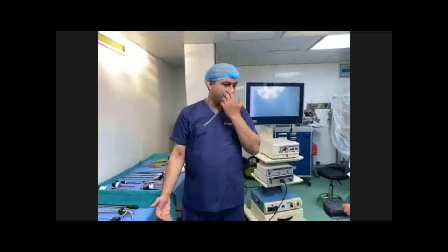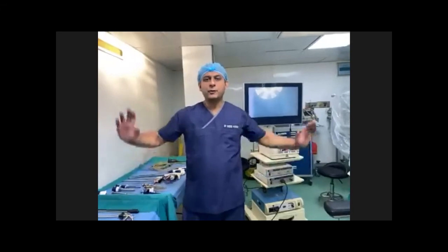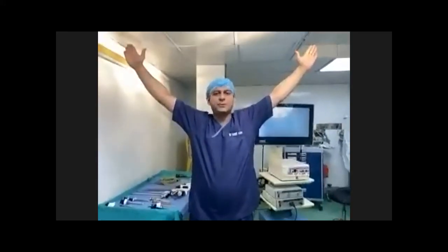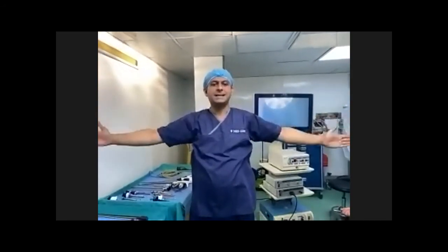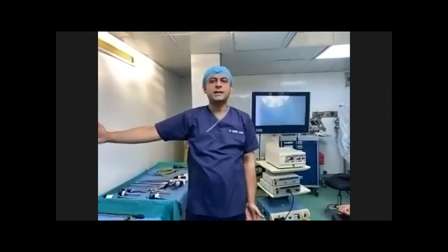I will demonstrate on the patient as well. If you put the arms like this, above 90 degrees, and the procedure is long enough, 1 to 1.5 hours, it will cause brachial plexus injury. So you have to be very careful. Either place the arms up to 90 degrees or less during the procedure. It is better to tuck in at least the arm towards the side of the surgeon, and if possible, tuck in both arms. I'll show you how to tuck in both arms.